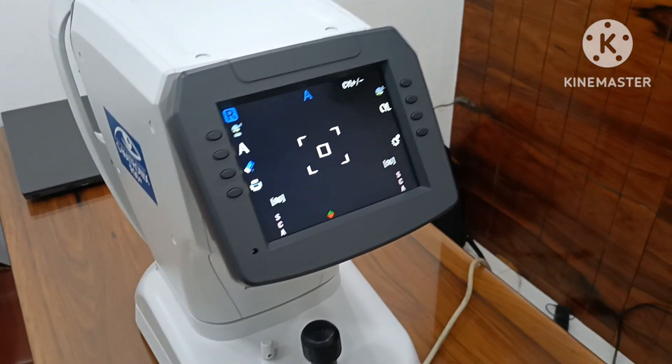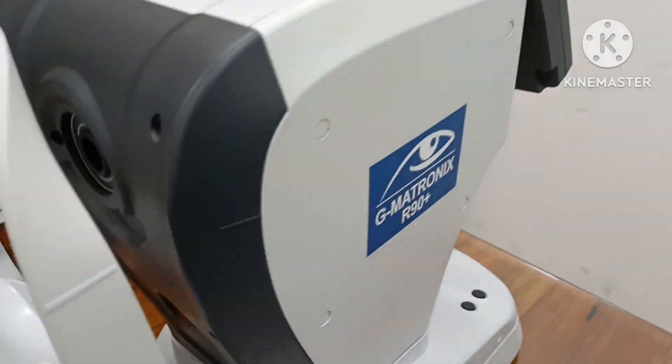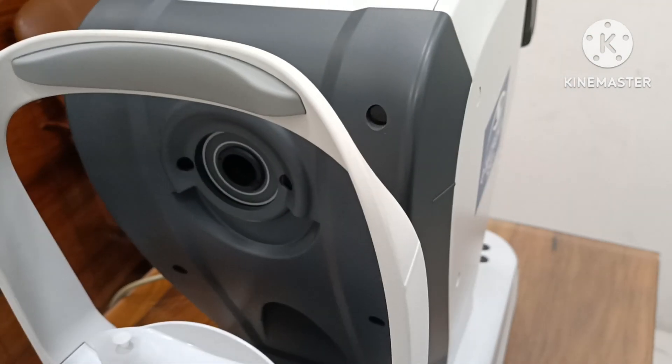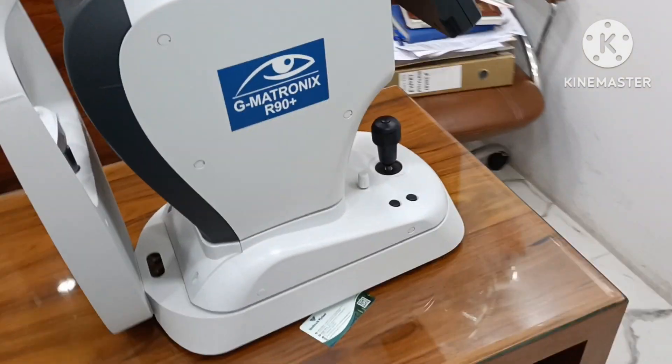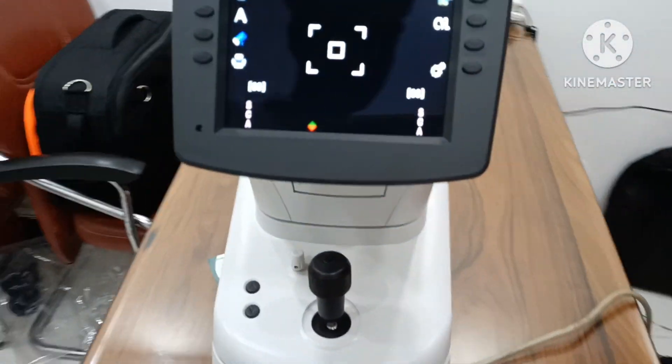Autoref Rectometer G-Metronix R90 Plus with 95% accuracy. This autoref you can operate very easily.